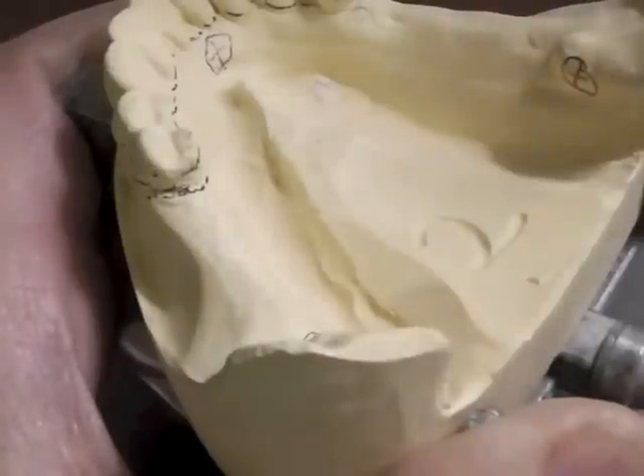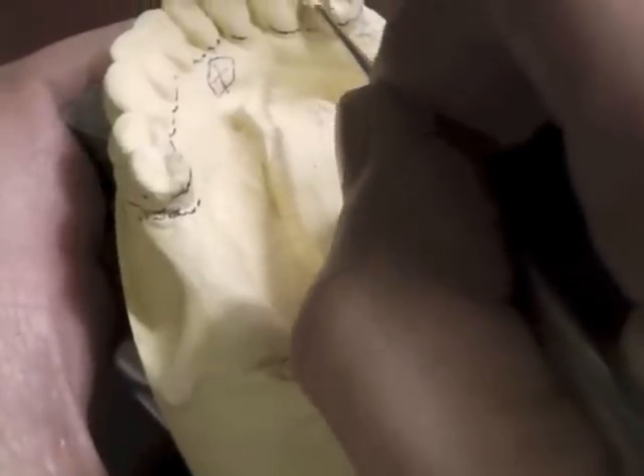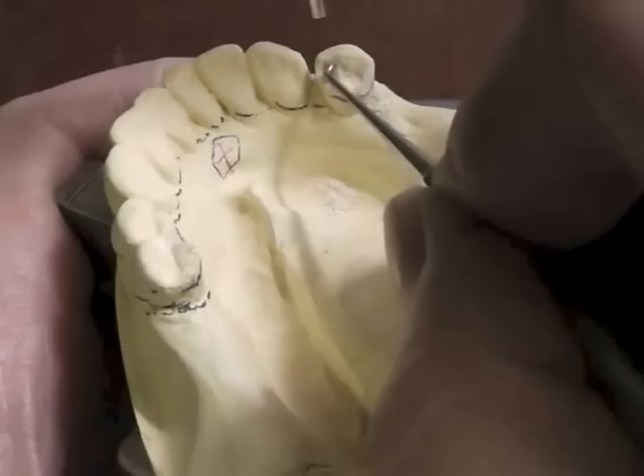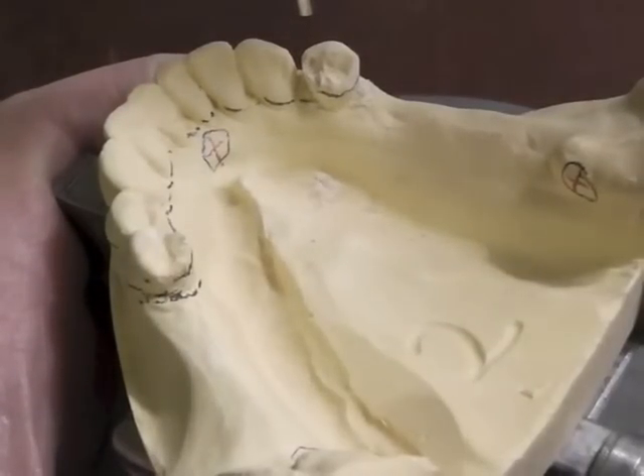Then I would reduce in the fossa enough to have a positive seat where my rest does not slide off or move the tooth in any particular direction. At the same time, I'm preparing a little sluice way, and I think we have a positive seat that's not going to fall off.